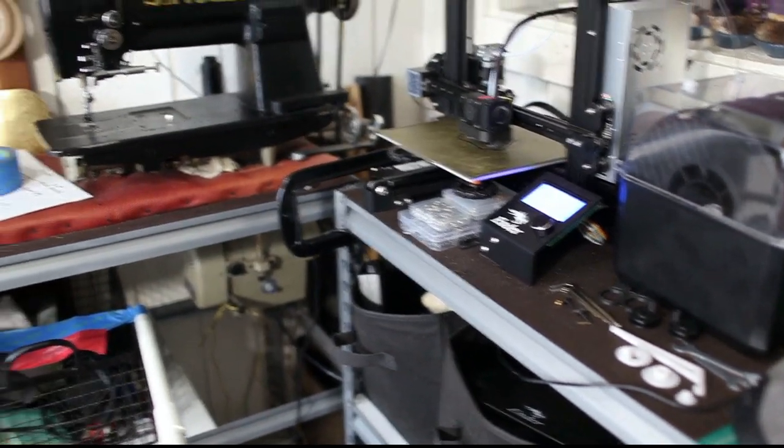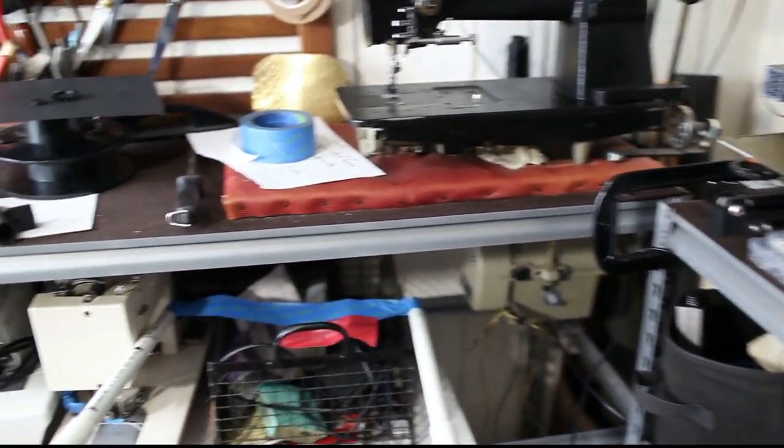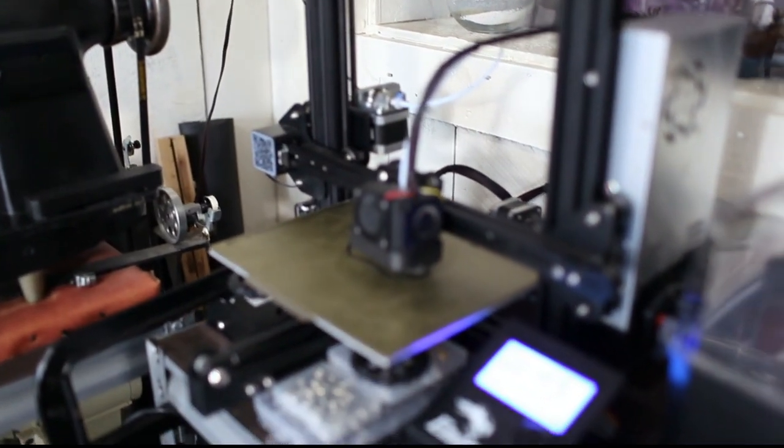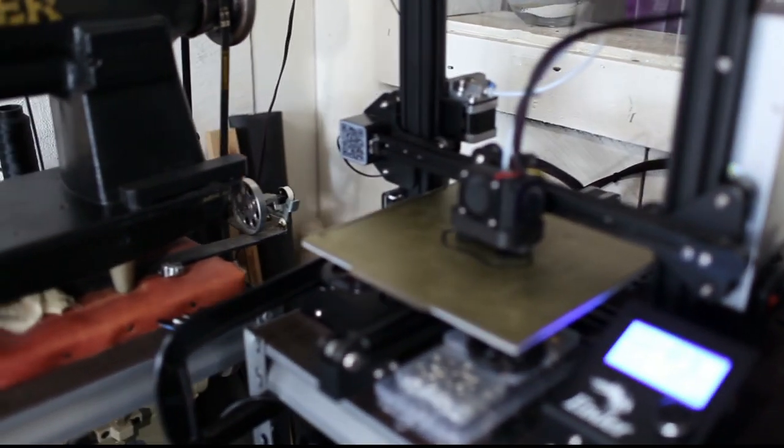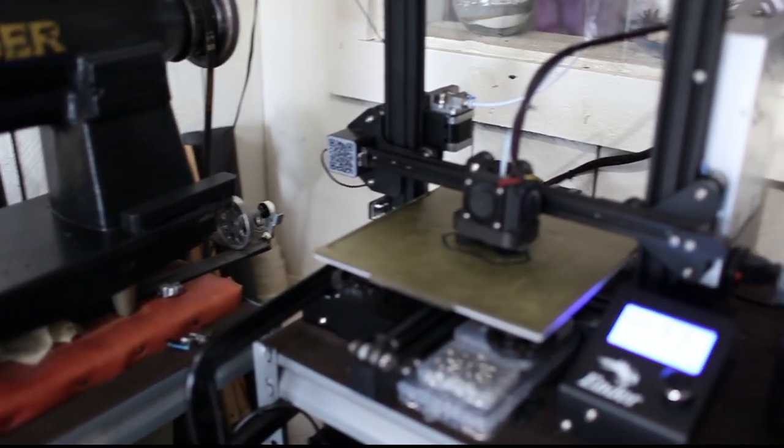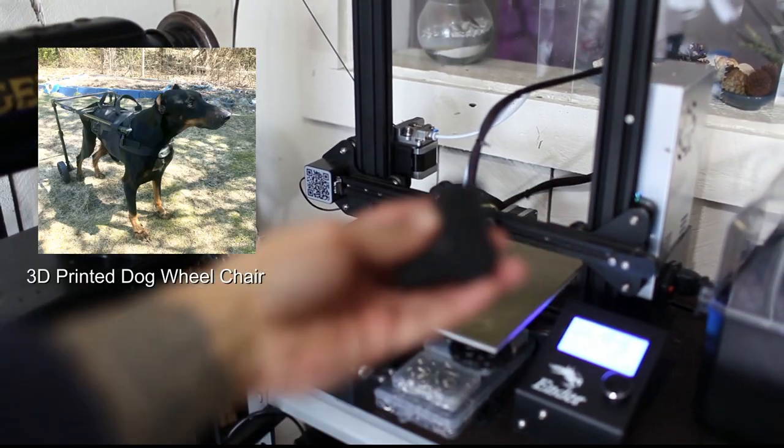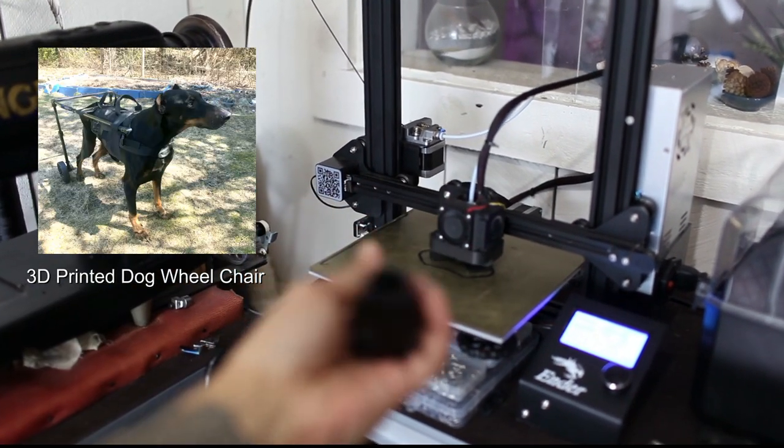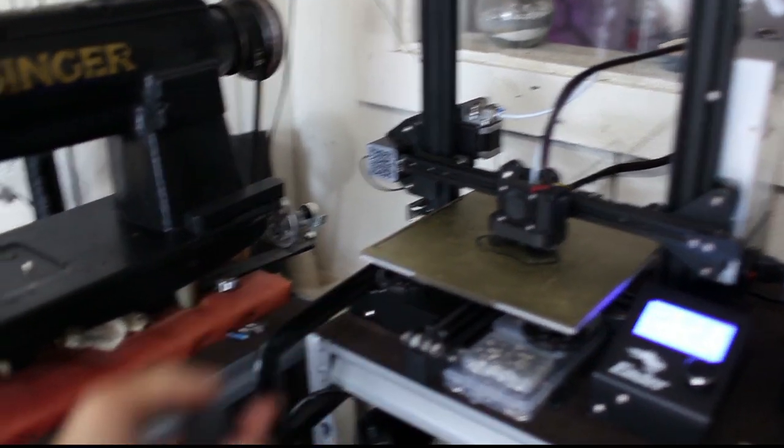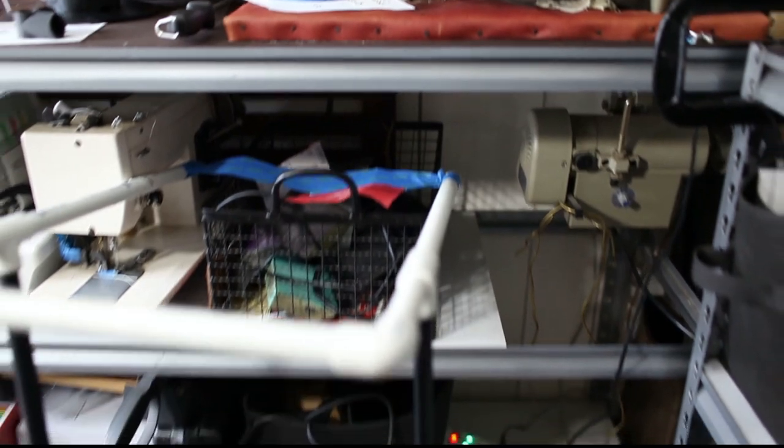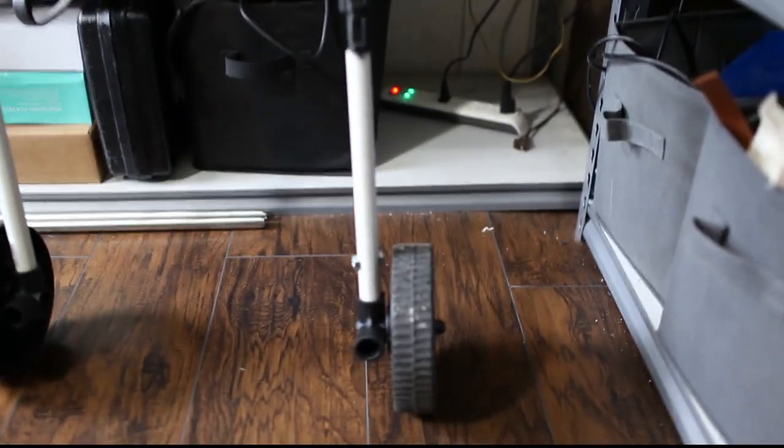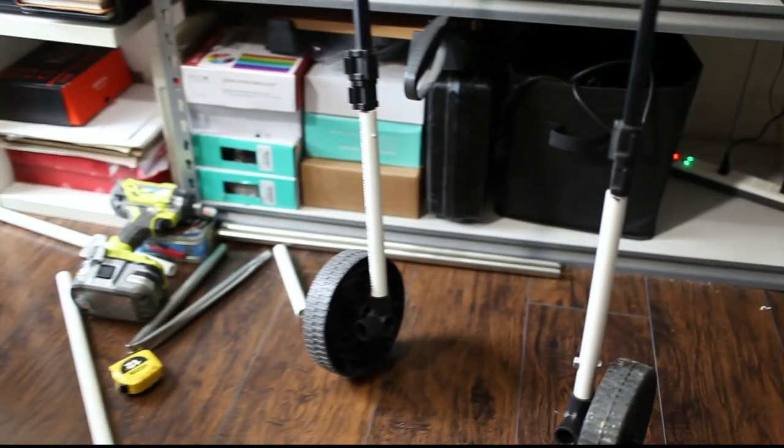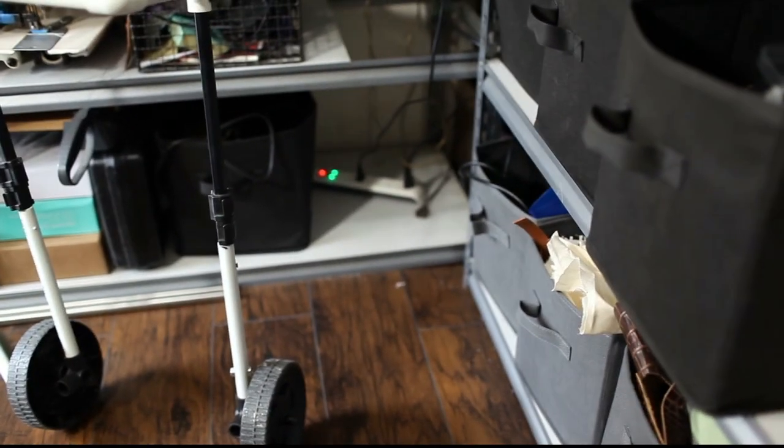Hello guys, welcome back. I've been running my Ender 3 non-stop for the last few days making parts for a wheelchair. Let me see if you can see it. I'm making a wheelchair for my dog using PVC pipes and some 3D printed parts.